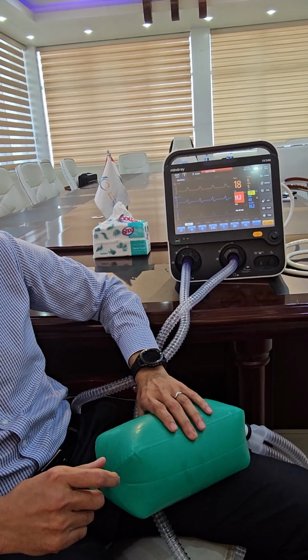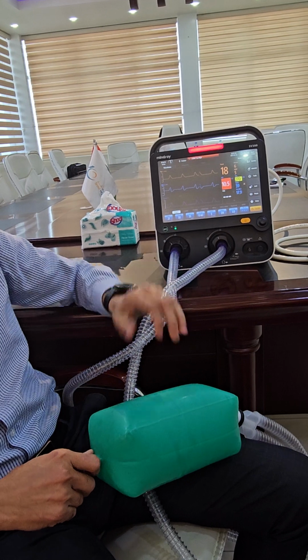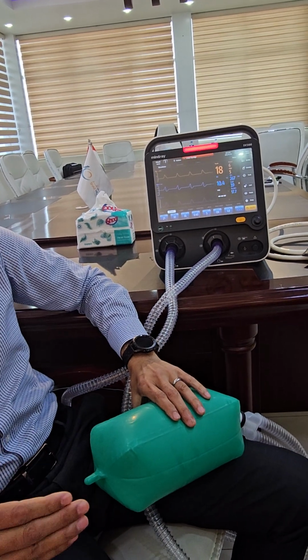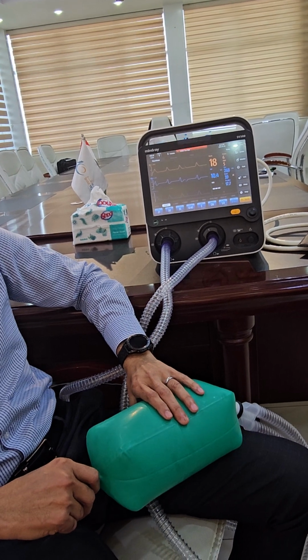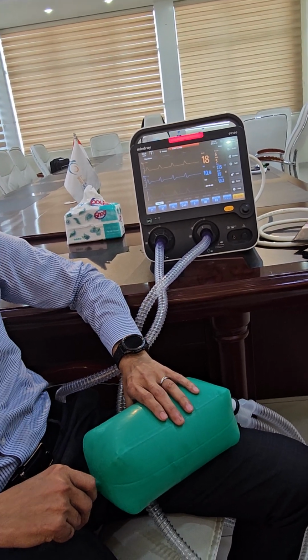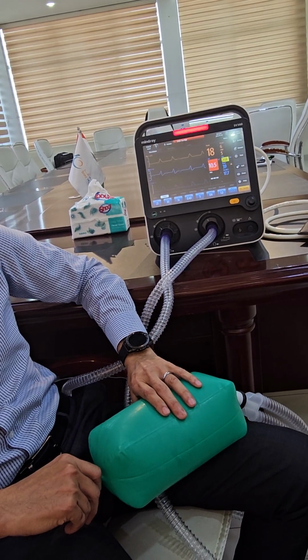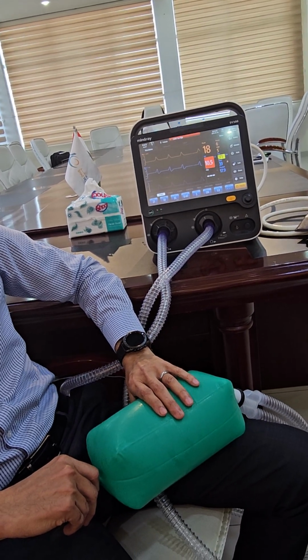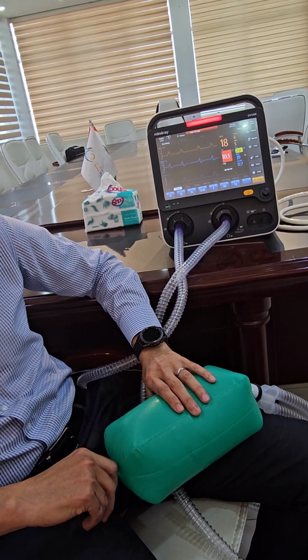Then you have to support. So you might escalate the support, and then you always have to go back to room air. Once you need FiO2 more than 30% for more than 15 minutes, there is something wrong, either with the patient or the machine. So never ever give oxygen more than 30%, even if you are an adult. It should be heated, humidified, blended, and it should be room air.